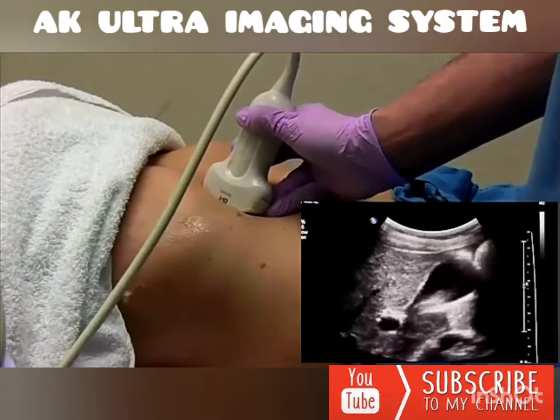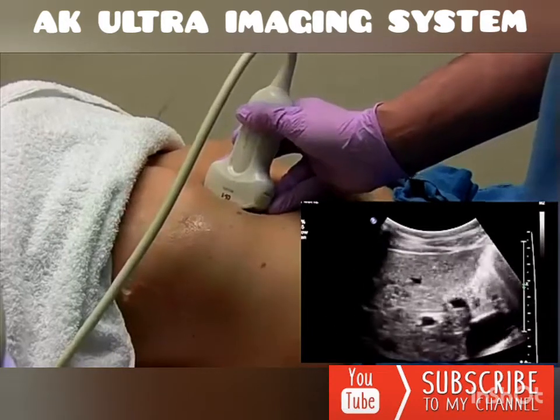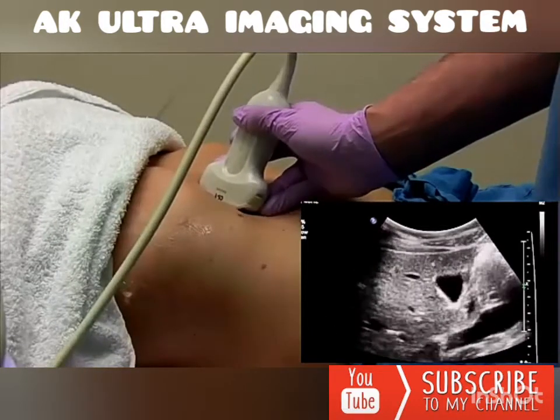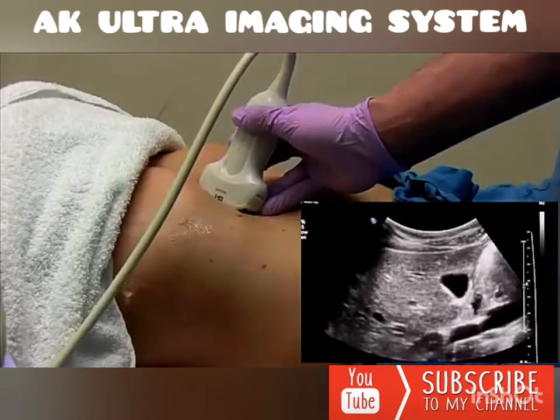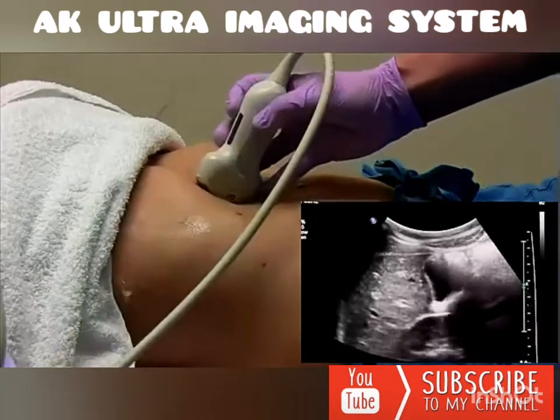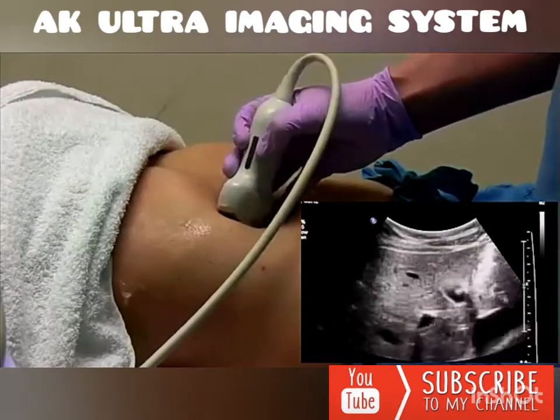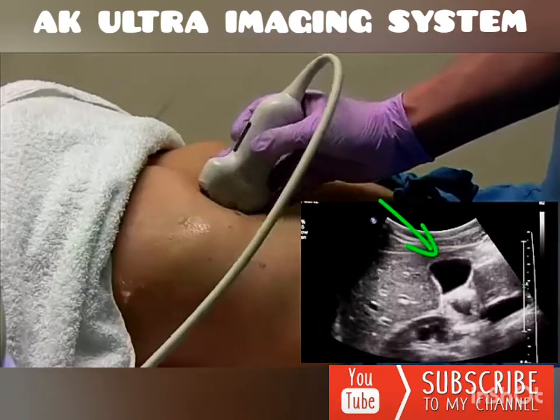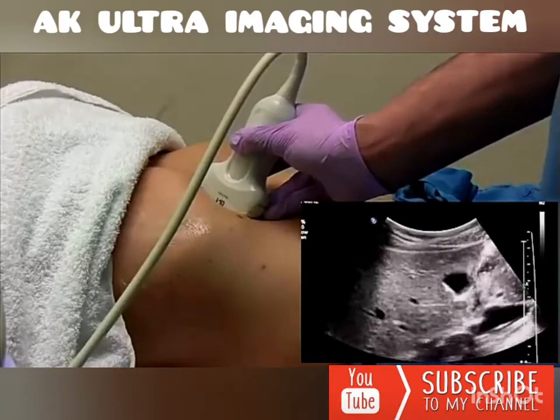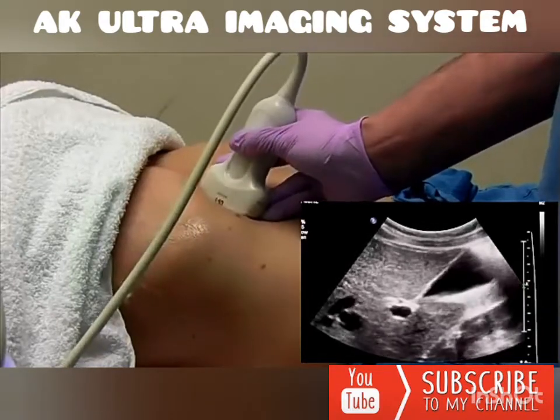Next, we'll get a transverse image of the gallbladder in this same window. What you want to do is just look at your probe and think about in your head, if you turn your probe 90 degrees, you should be perfectly set up for a transverse gallbladder. So this is our transverse plane, and if you go back 90 degrees the other way, this should be your sagittal plane here.